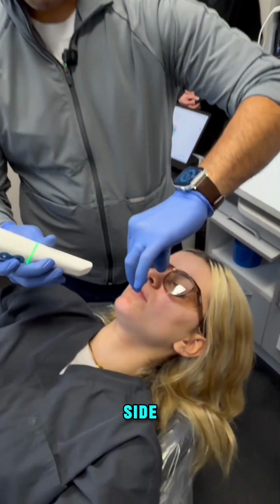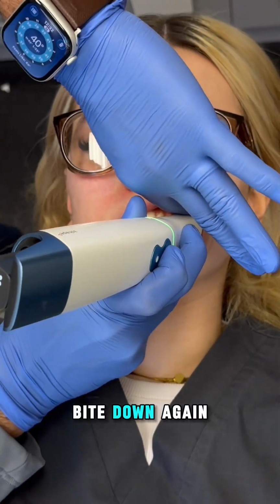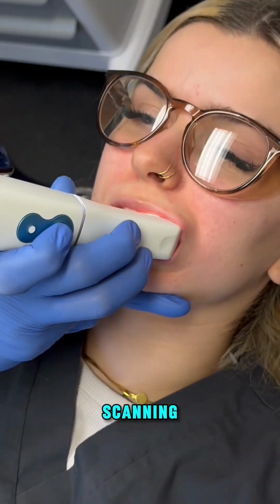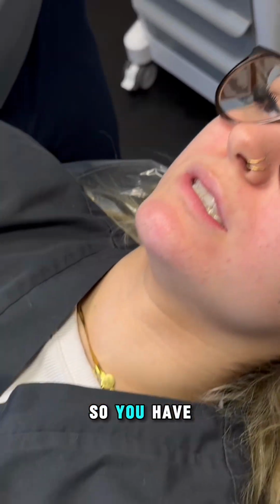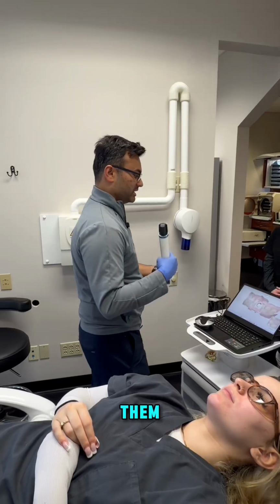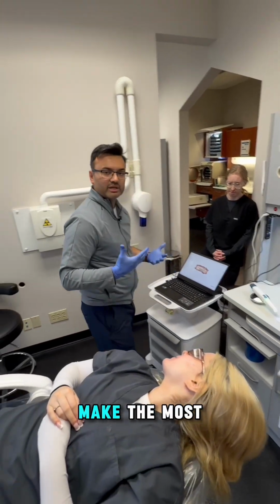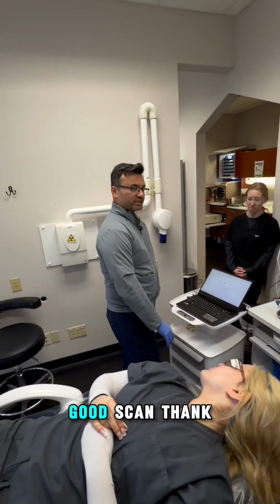Now come back to the other side, open wide. Now I'll retract, bite down. Again, my 1 finger always stays right here so that I'm scanning, and I can feel if there is any movement. So you have two hands, use them. There's a reason why dentistry is called four-handed, because you are supposed to make the most use of these things. So that's how you get a good scan.